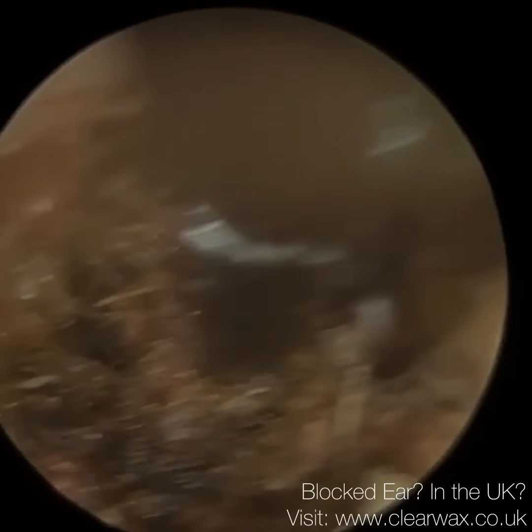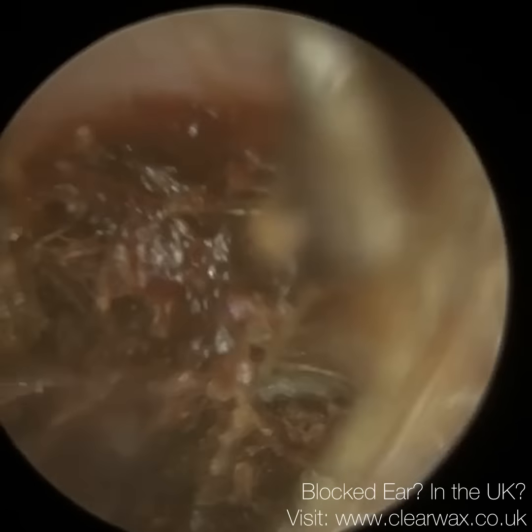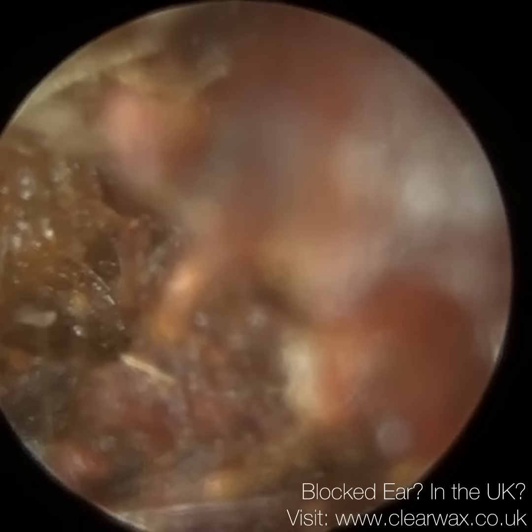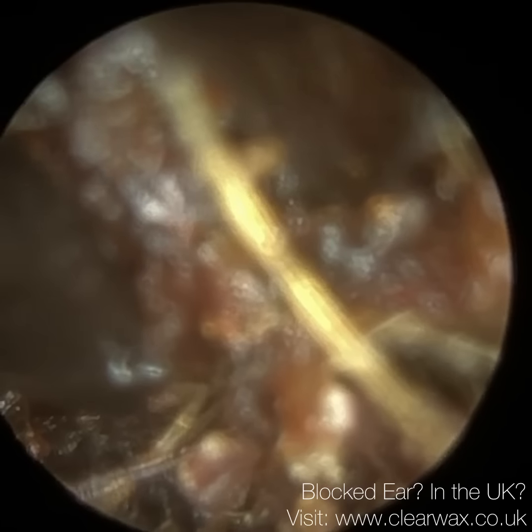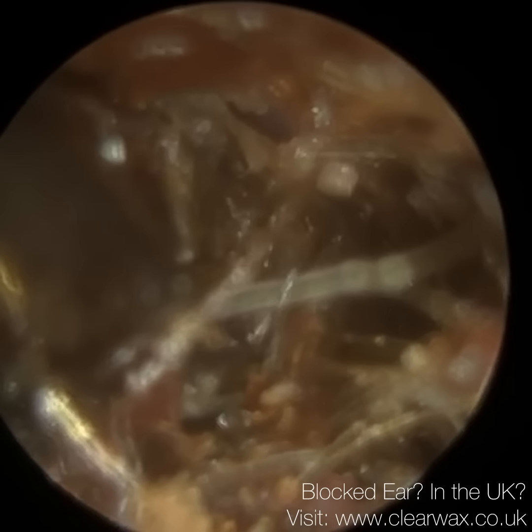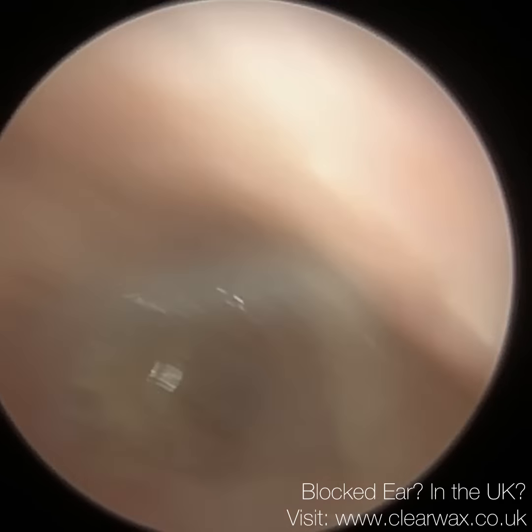And you may tell by the orientation of the view, this patient's head was leaning forwards. So normally what you're seeing on screen at 9 o'clock will present itself around 12 o'clock. But because this patient's head was leaning forwards, we have this skewed view. So I'm just using the forceps again, and the suction wasn't really beneficial at this stage. It does assist a bit later on in the video.